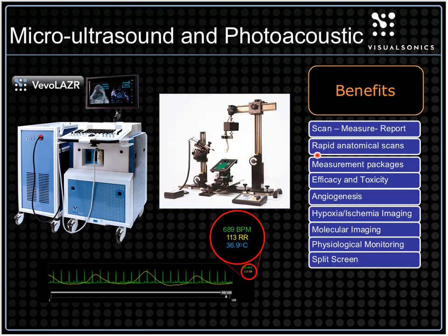I'd like you to keep in mind that this is one of the imaging modalities that provides you the output of physiological parameters. This is very important for cancer biology, to make sure that the imaging is conducted in a consistent fashion, and that changes in body temperature or heart rate do not affect either the drug delivery or the drug efficacy.